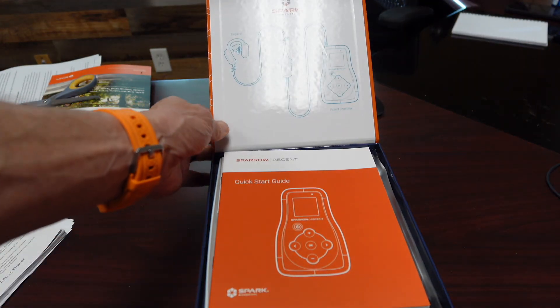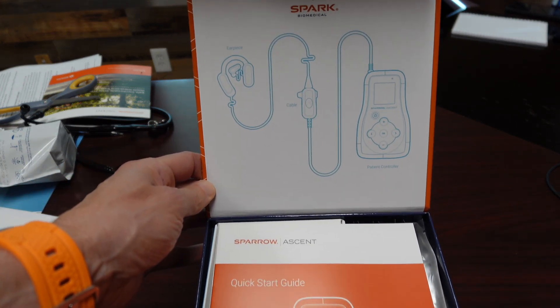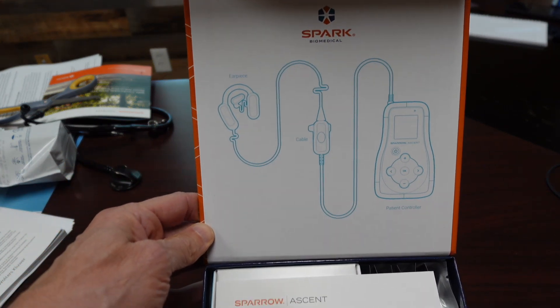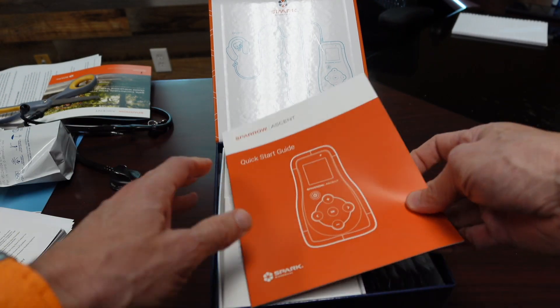This is similar to the older Bridge device, but this is significantly better. The Bridge device was disposable — you put it on for five days and threw it away. You couldn't turn it on, you couldn't turn it off, you couldn't adjust it. You didn't even know if it was working after a little bit of time.